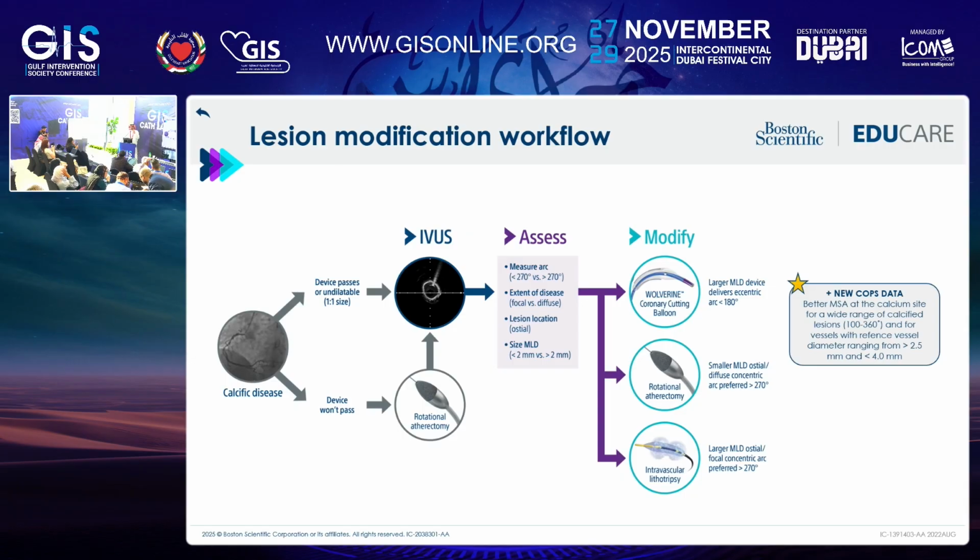But the expertise in your cath lab in preparing the lesion has to follow a pathway. That pathway, based on the recent data, I could not tell you for sure that it has to be rota, it has to be the high pressure balloon or a cutting balloon. But there has to be a way for you to debulk that calcification, because the worst thing that can happen is to put a stent in a heavily calcified area and you end up with an underdeployed stent. Underexpanded. This is what we are trying to prevent.